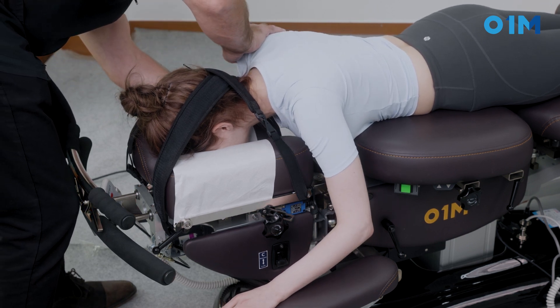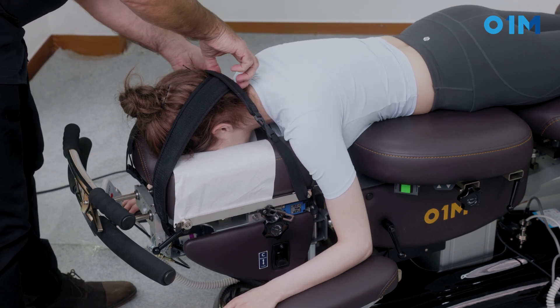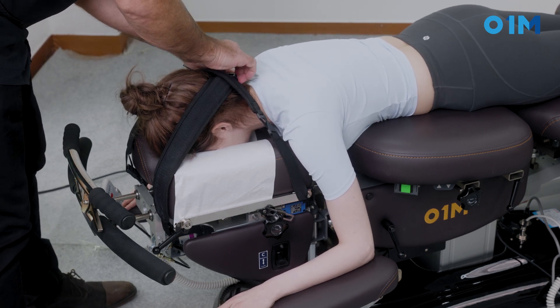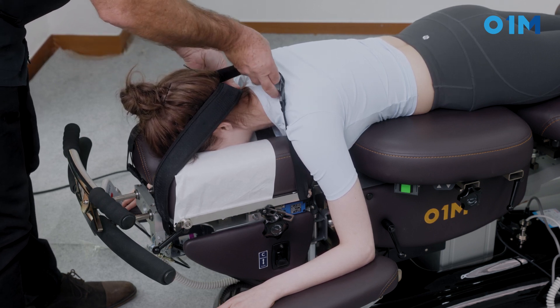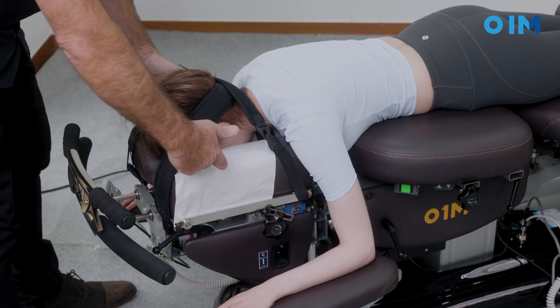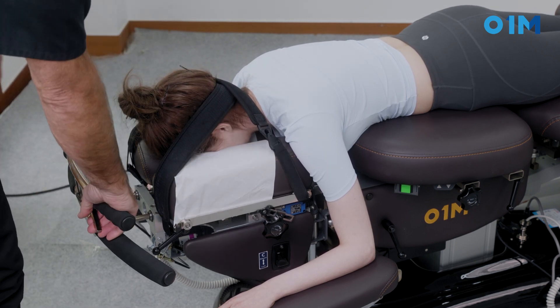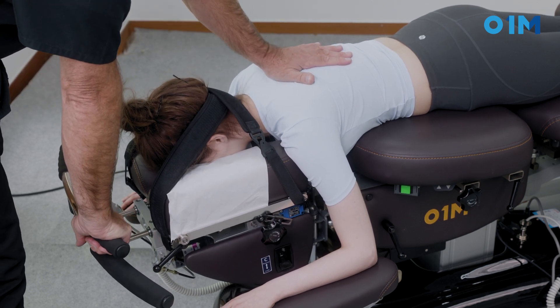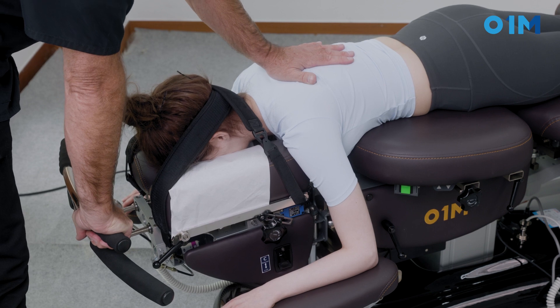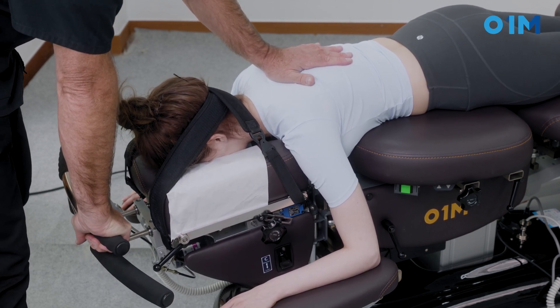Excuse me — can you raise your shoulder? I locked it up and now we're nice and tight. This should be tight on the cephalad portion. Now I'm ready to go, and I'm going to gently bend that. You can see how it tightens up nicely the upper cervical part.